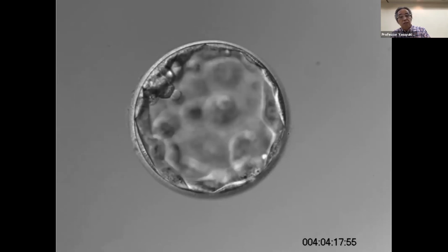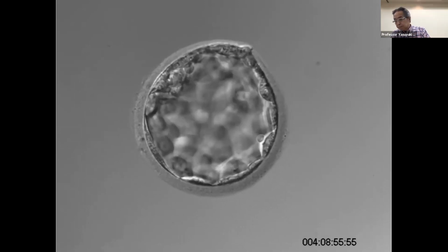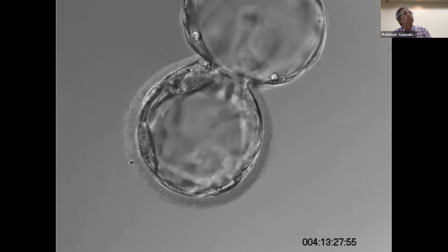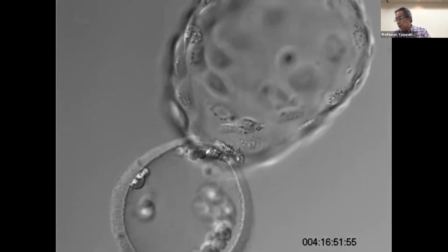After fully expanding, collapse of the cavity occurred and then the zona cracked. The blastocyst escapes through the cracked side of the zona. This is the process of hatching in a human embryo.